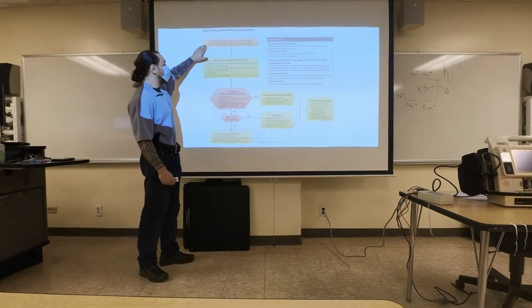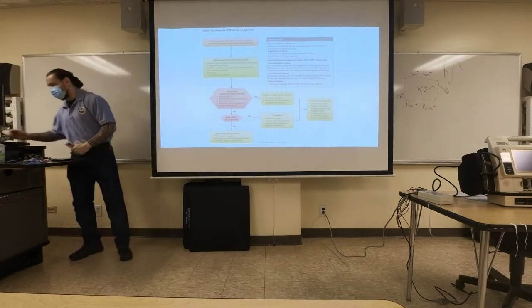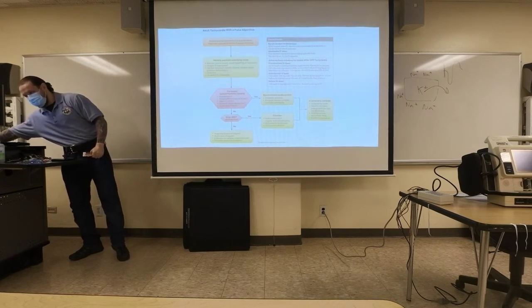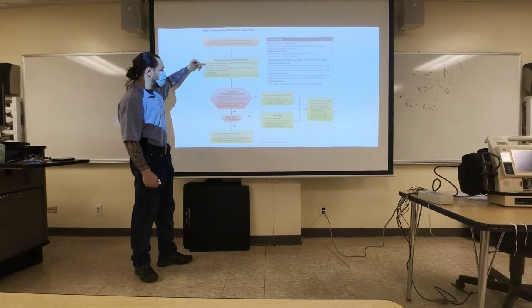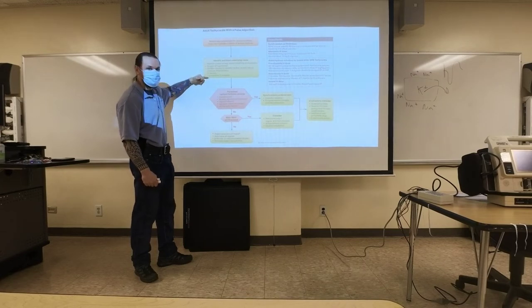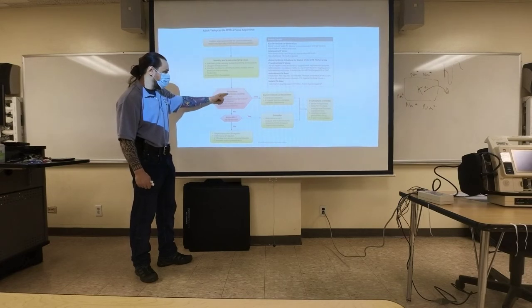Basically, it says you have a patient who has a heart rate typically greater than 150 beats per minute, so they have sustained ventricular tachycardia. We're going to identify the rhythm, and the next thing they show you is what you're going to be doing. You're going to maintain their airway, give them oxygen if they're hypoxic, place them on cardiac monitoring, get IV access, and do a 12-lead EKG. That's standard. And then they go down.